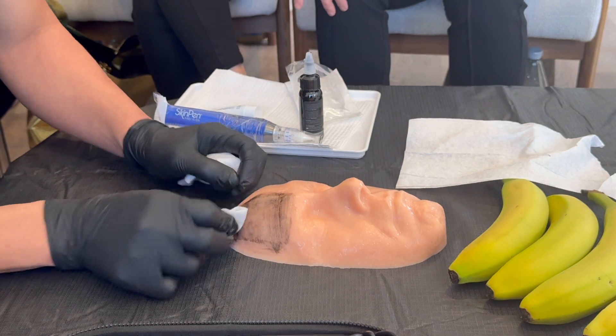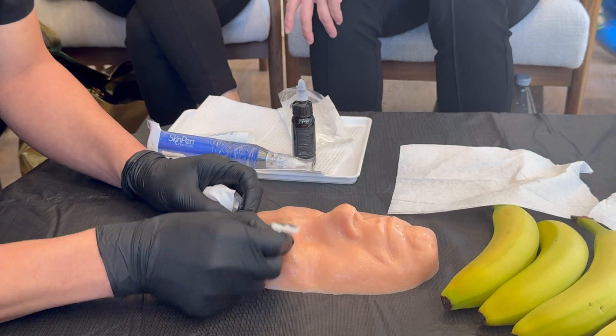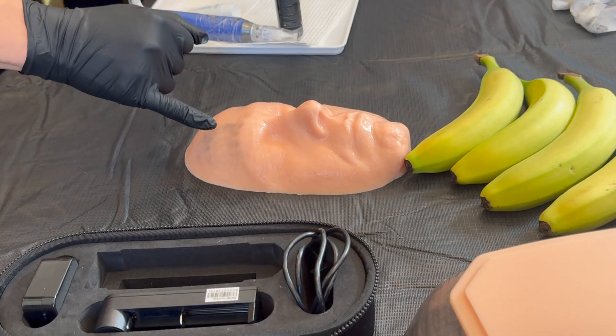Second thoughts. Maybe not. It's black — if it's black, it's liver. Yeah, I see a little bit of black. There are areas where obviously I don't have that.